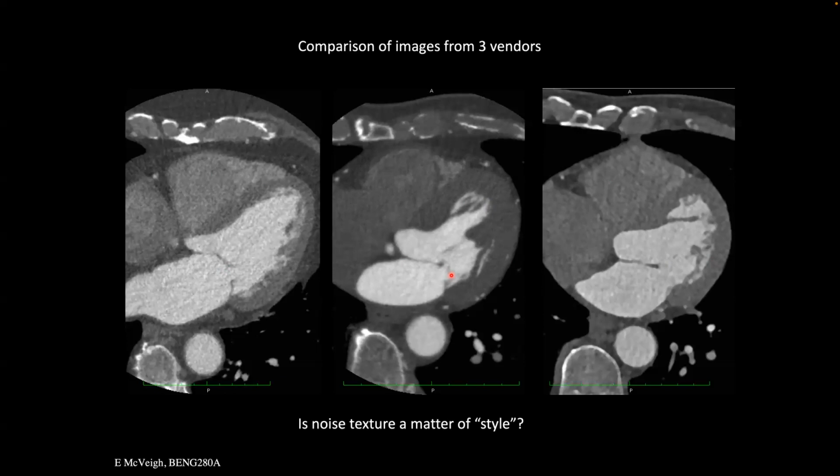It's not like, where's my physics person? Let me do some tests on the point spread function and the MTF. And they're not going to ever go to this vendor and say, your MTF is 10% smaller at this spatial frequency. That's for us to figure out, when you get the machine and you try and figure out what you can actually state is your true resolution. But the way these things are sold is exactly what you've all just done. You look at it and go, I have confidence that I can read that.